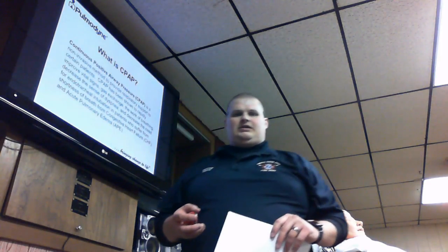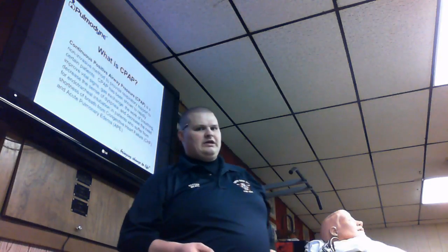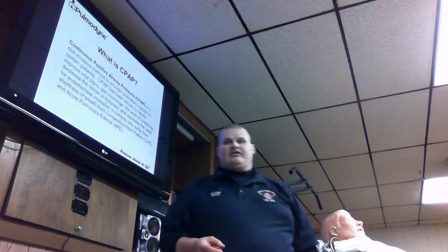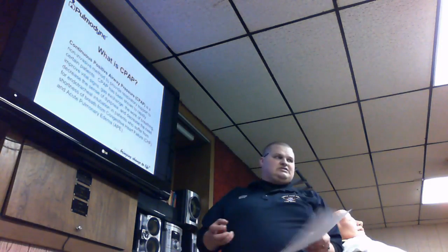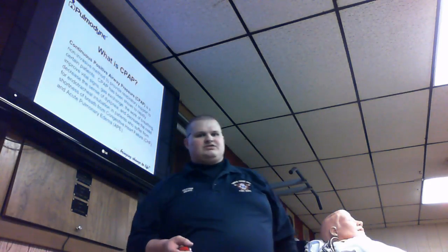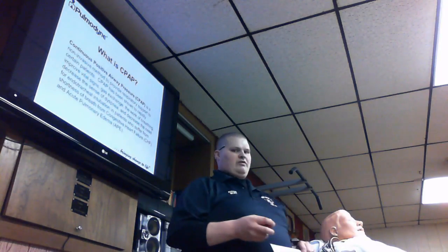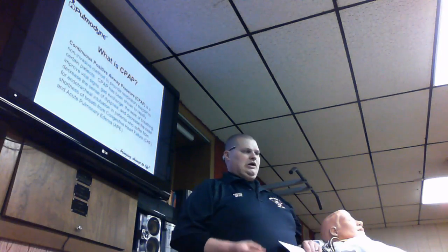So moving forward, what is CPAP? CPAP is a non-invasive method to provide respiratory support to certain patients. It has been shown to rapidly improve vital signs, gas exchange, and the work of breathing, decrease the sensation of dyspnea, and decrease the need for endotracheal intubation in the field. It also helps improve shortness of breath related to congestive heart failure and acute pulmonary edema. So those are going to be your two things.